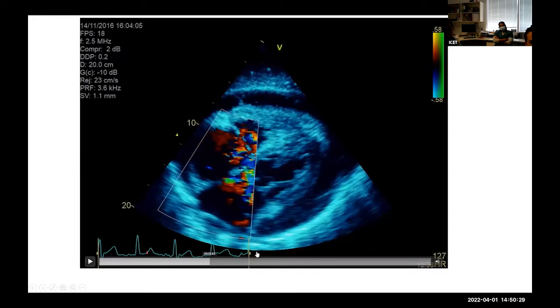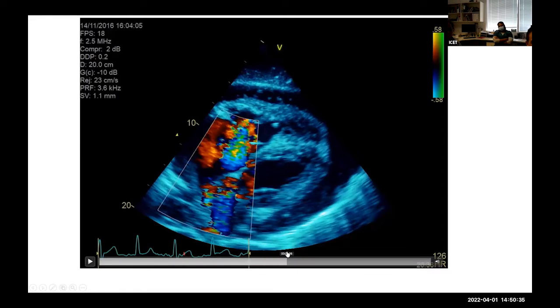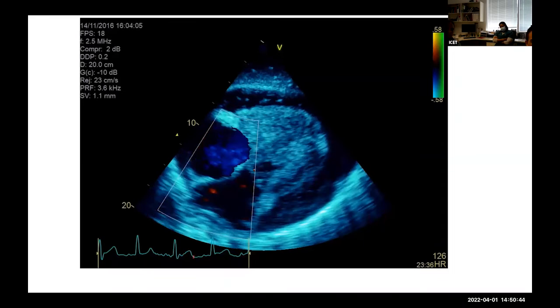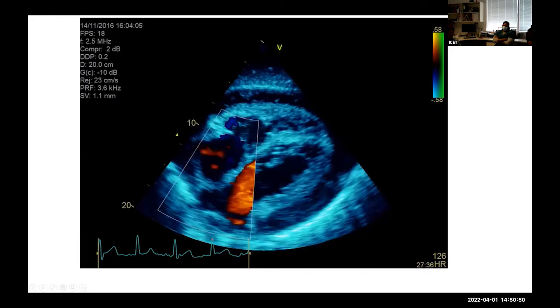So I've got tricuspid regurgitation that is at least moderate, if not large. I'd like to pulse the hepatic veins and get a cursor through there to get the maximum velocity. That's probably mitral regurgitation I'm seeing as well, but on this angle, I'd need to be sure I'm not catching anything to do with the left ventricular outflow tract.